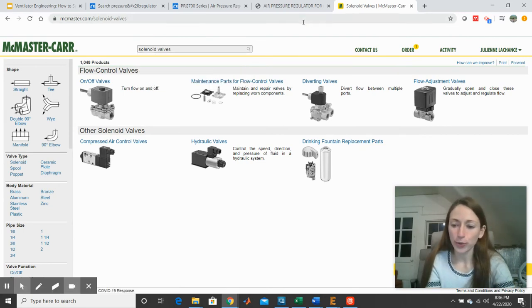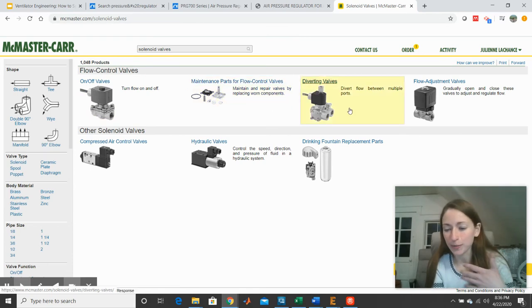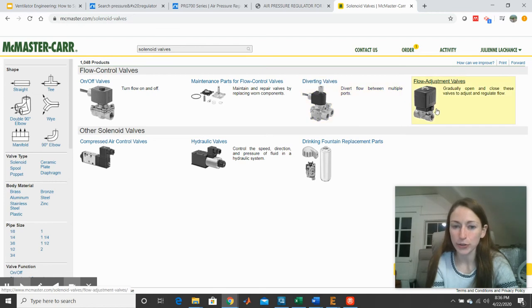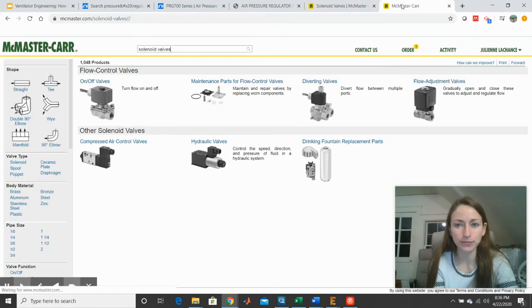Okay, great. So in searching for that on McMaster, I see a number of different options that we may consider. There are on-off valves. That's what McMaster-Carr calls process valves. We see some maintenance parts, diverting valves. I don't really care about. Maybe you will use these in your devices. Flow adjustment valves, hydraulic valves. I also don't care about hydraulics, and I don't care about drinking fountain replacement parts. We're really focusing on these two categories of devices. So we're comparing these process valves to these control valves, and both are types of solenoids. I'm going to start by looking at the process valves here. Okay.